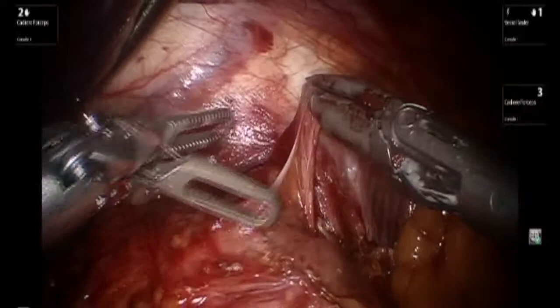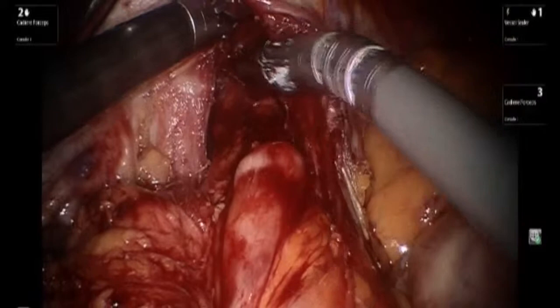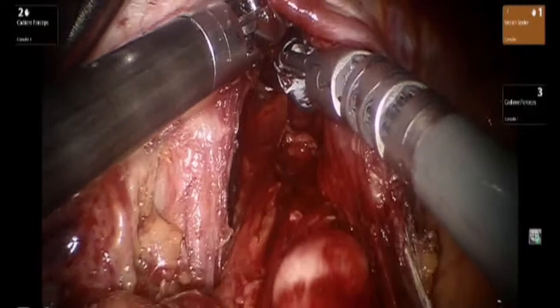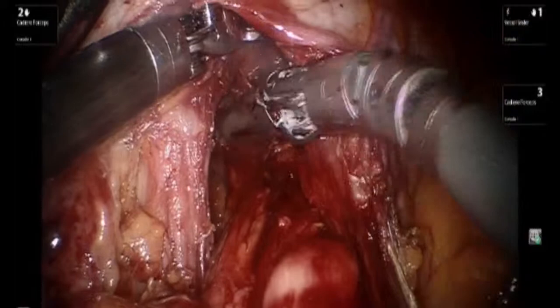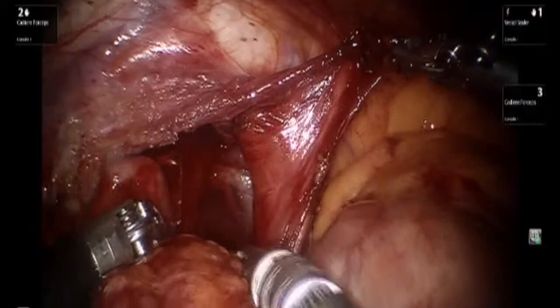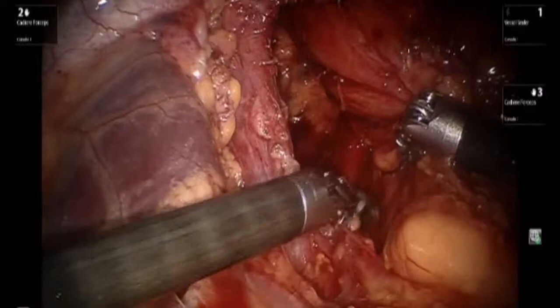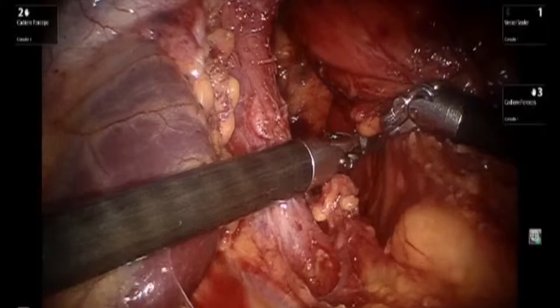One can see the hernia sac being attenuated. Attachments to the left crus are completely mobilized and freed up, and this will allow one to make the retroesophageal window opening more easily.